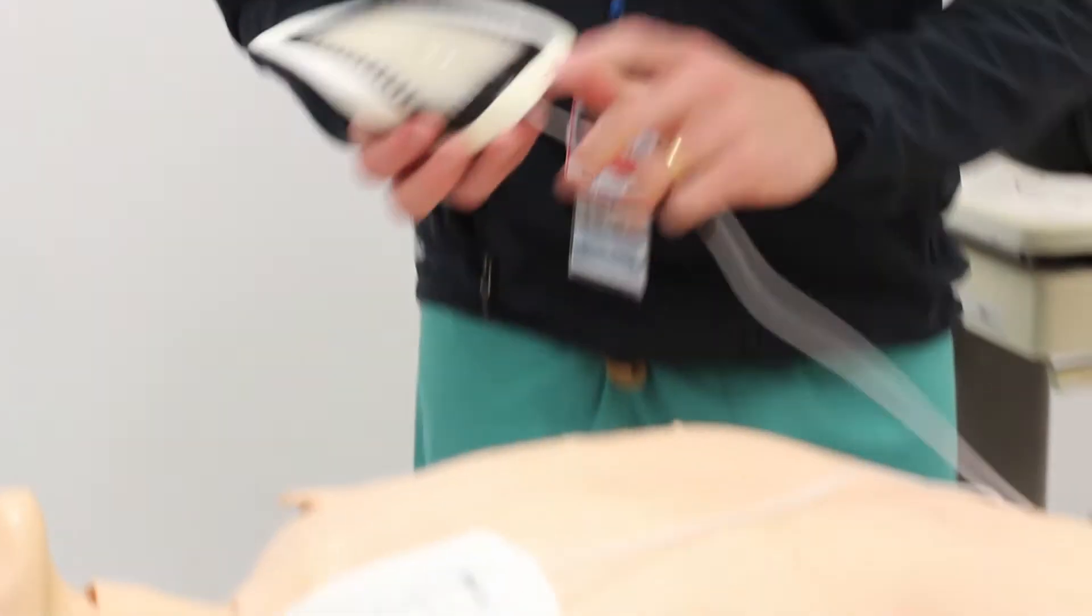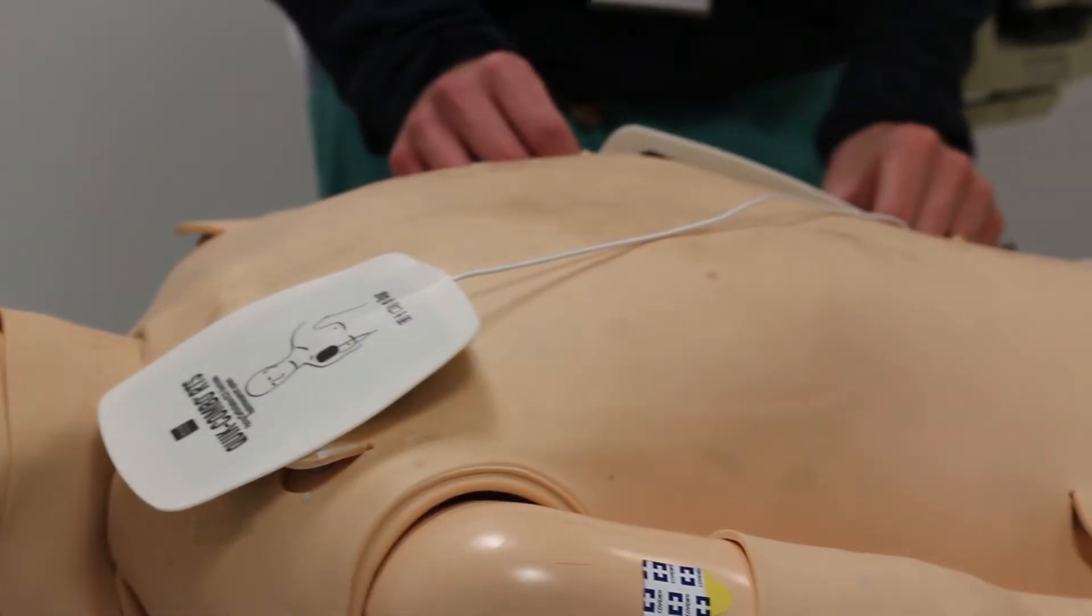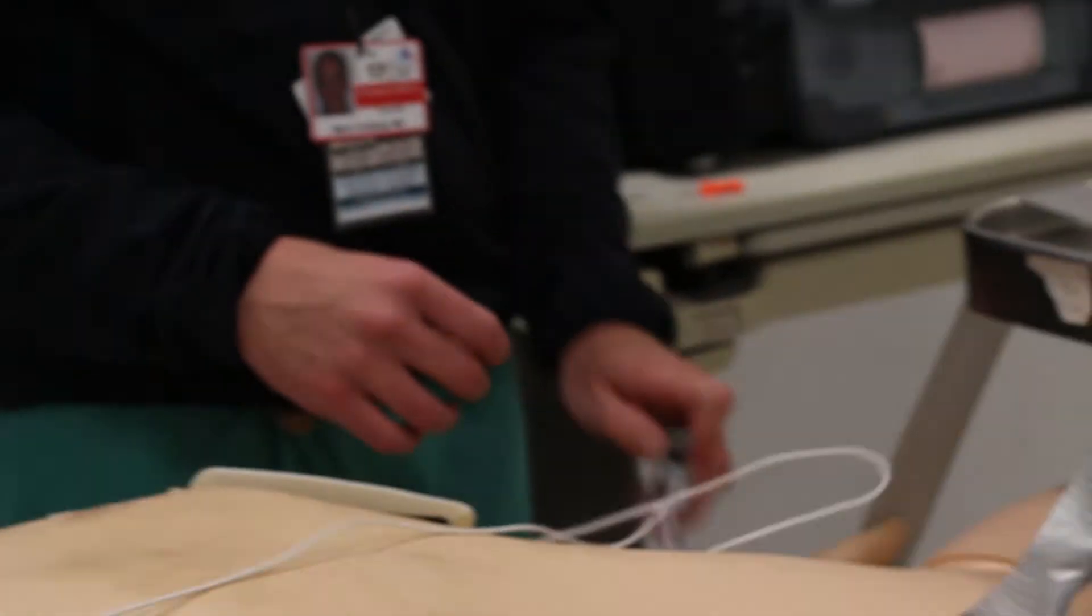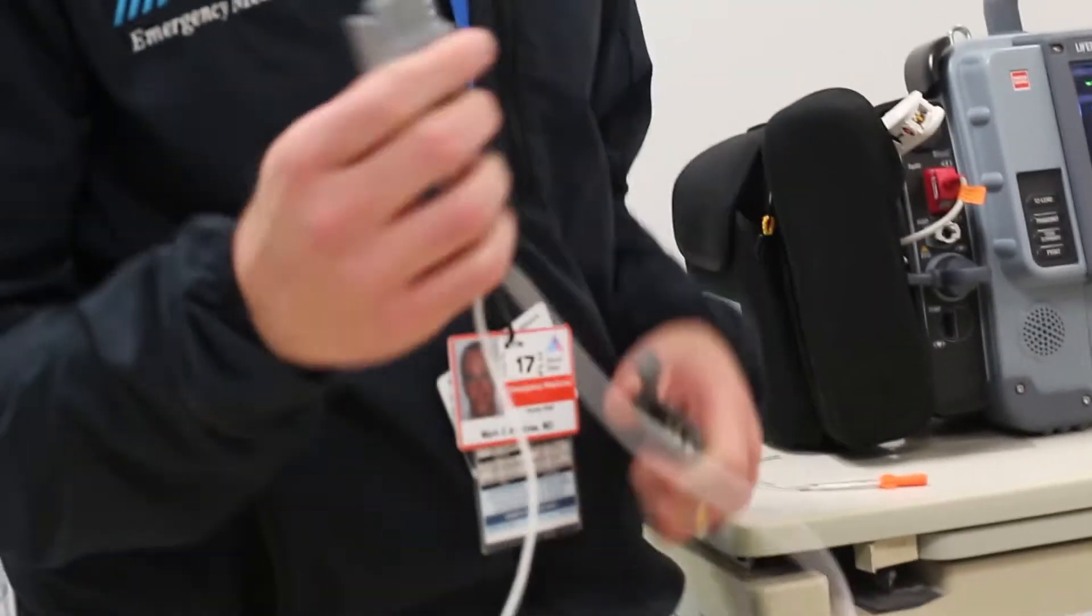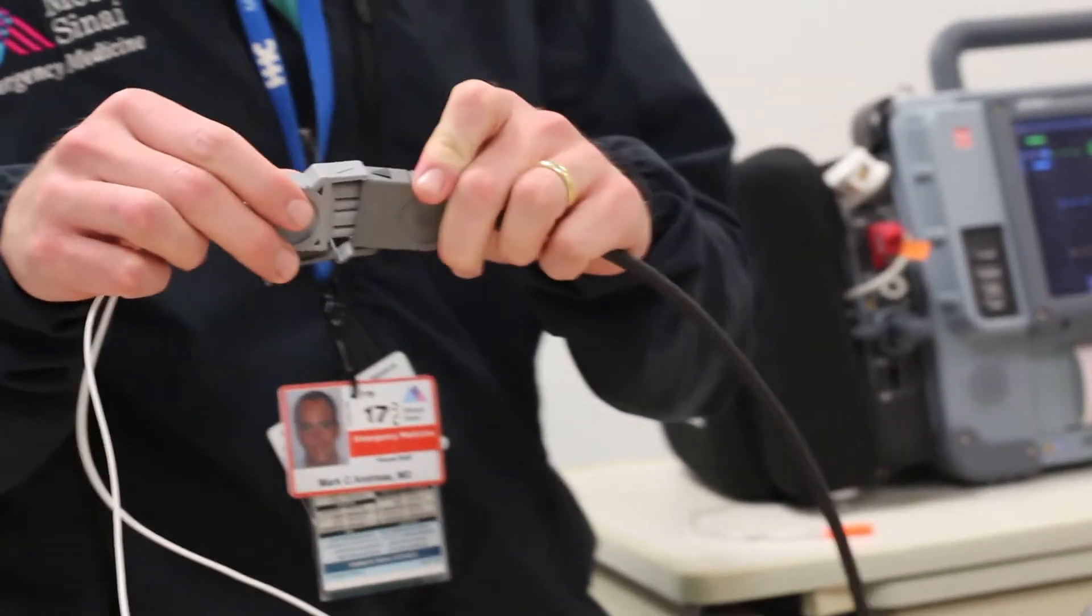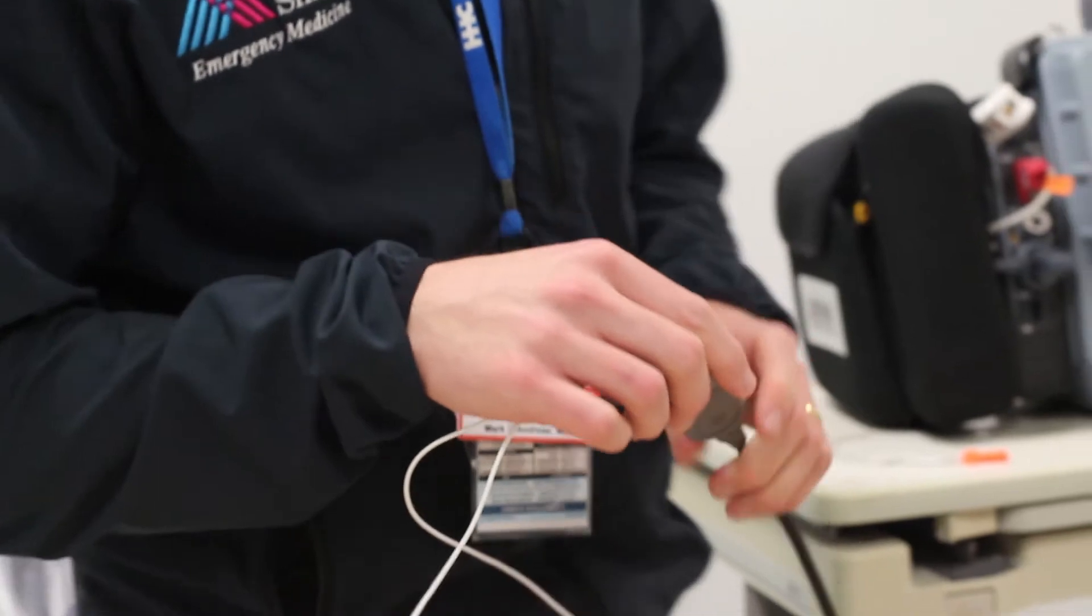The pads go in the standard placement and function as your 3-lead ECG. If you're receiving a cardiac arrest from one of the Mount Sinai ambulances, they use the same unit. You'll be able to unplug their pads and plug them into our unit. With that, I'm going to switch the pads on the patient.